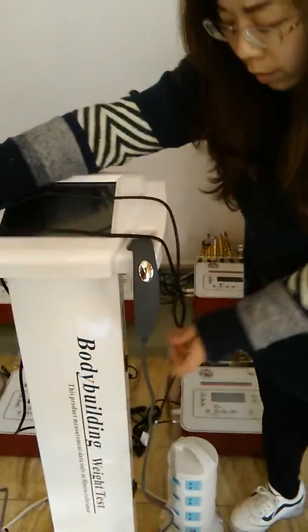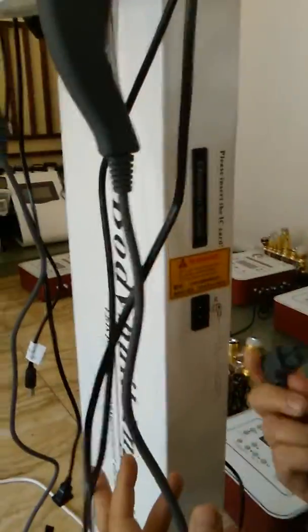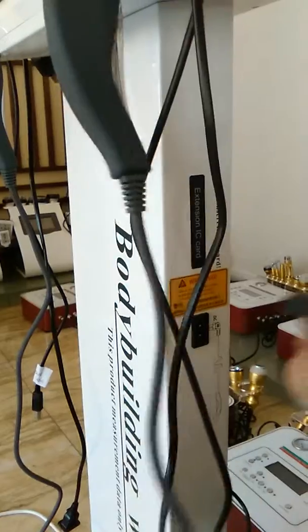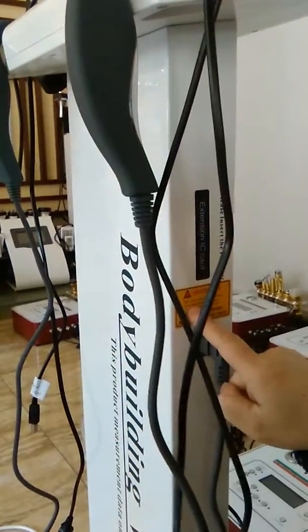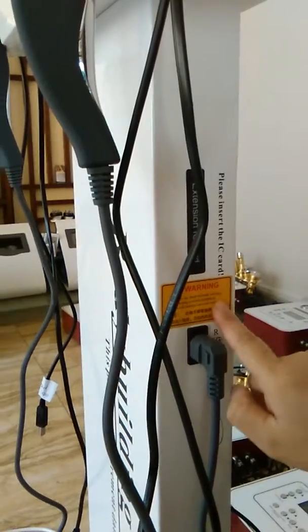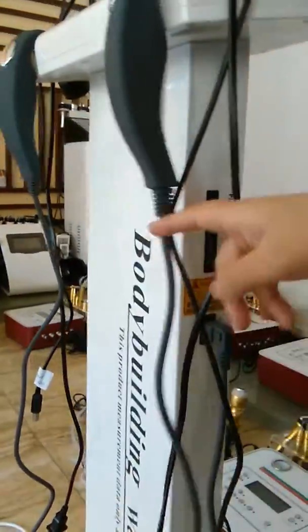Please remember, you can see this is the handle electric interface. Only can link this handle line here. Power plug is strictly prohibited, or it will endanger personal safety. So only the handle line can be entered here.